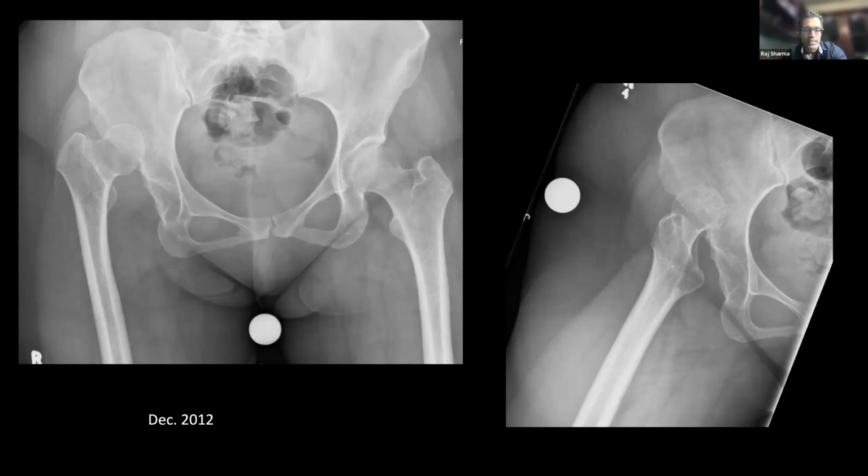So I'm thinking things like subtrochanteric osteotomy may be necessary. Really tight distal canal is expected in these types of dysplastic patients. Try to get the center of rotation on the acetabular side back to the native position. There's lots of bone there on the native acetabulum, so I'm not too concerned about getting fixation.